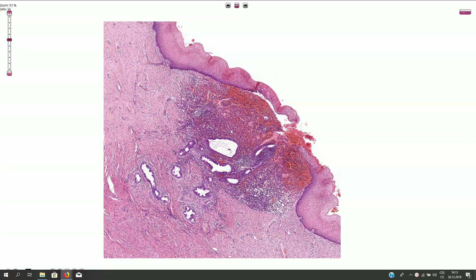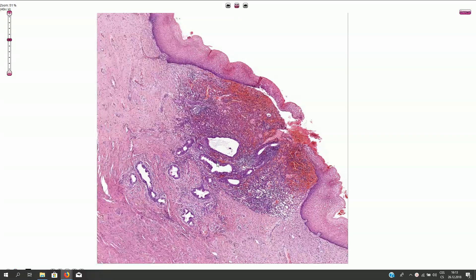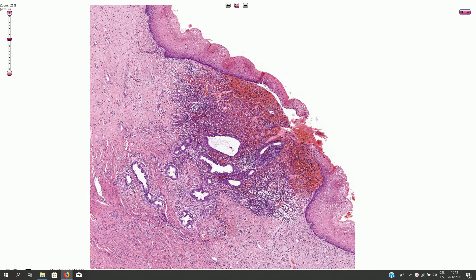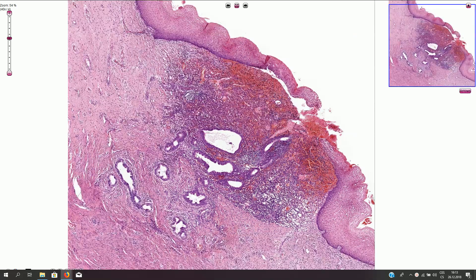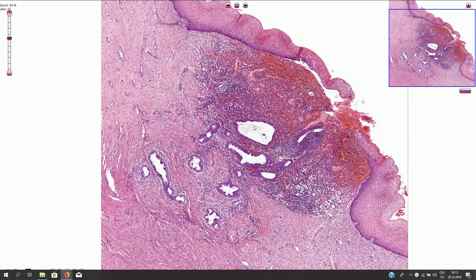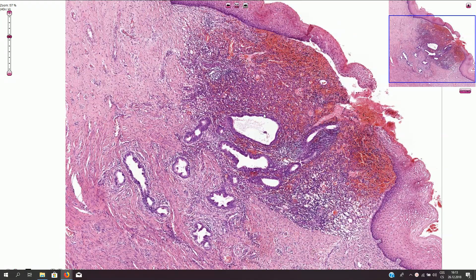This is the case of endometriosis of the uterine cervix. On the surface we see ectocervical non-keratinized stratified squamous epithelium, and here we have the focus of endometriosis composed of endometrial glands, endometrial stroma, and bleeding in the adjacent tissues.